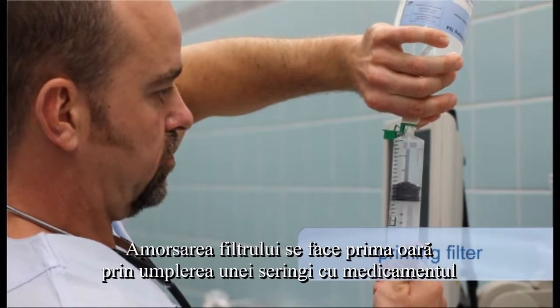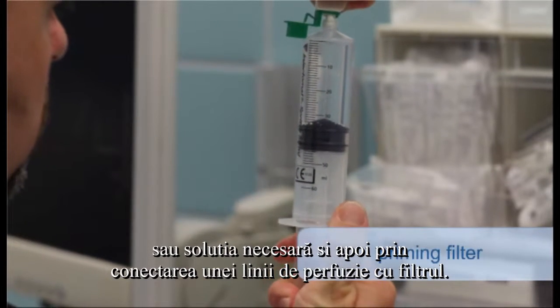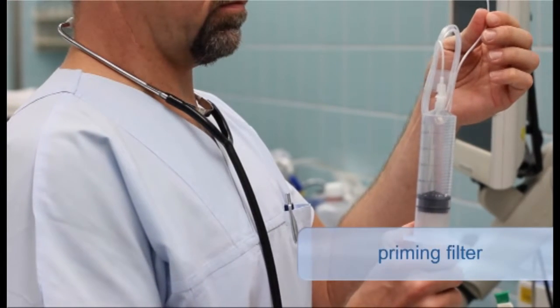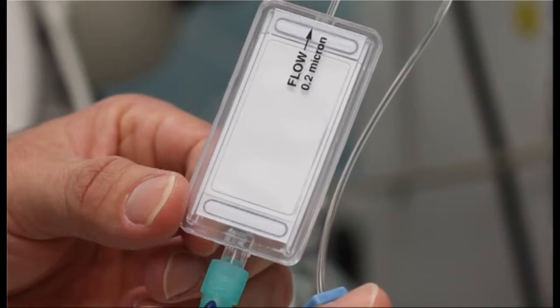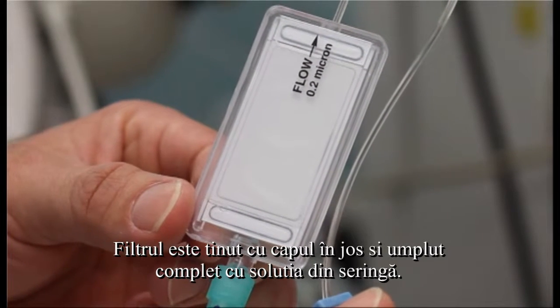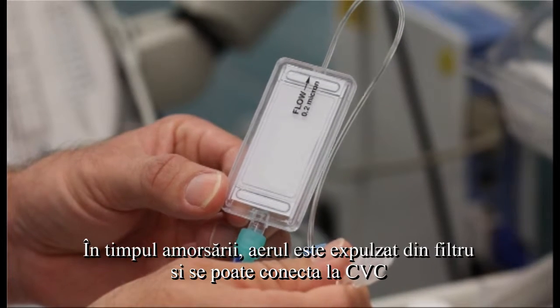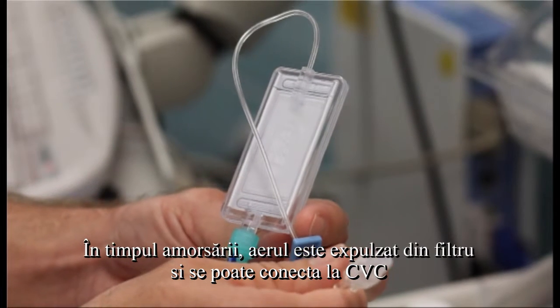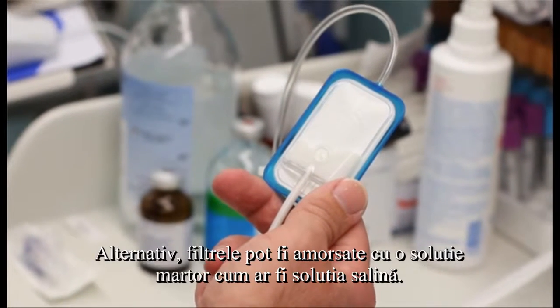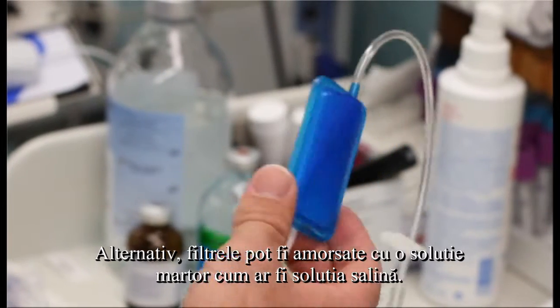Priming of the filter is done by first filling a syringe with the required drug or solution, and then connecting an infusion line and the filter. The filter is held upside down and completely filled with the solution from the syringe. During priming, air is expelled from the filter, and it can be connected to the CVC without the risk of air remaining in the system. Alternatively, filters can also be primed with a carrier solution, such as saline.